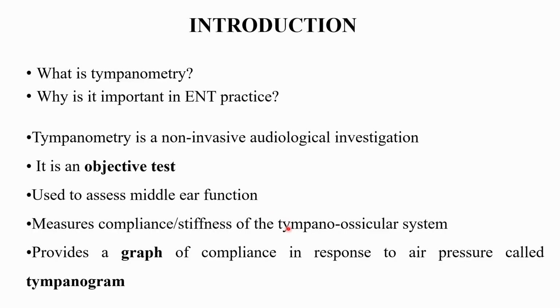This is of the tympano-ossicular system, meaning the tympanic membrane and the ossicles attached to it, that is, the mobility of the tympanic membrane and the ossicles. Due to this compliance, it provides a graph in response to air pressure, and that graph is known as a tympanogram, not tympanograph, tympanogram.